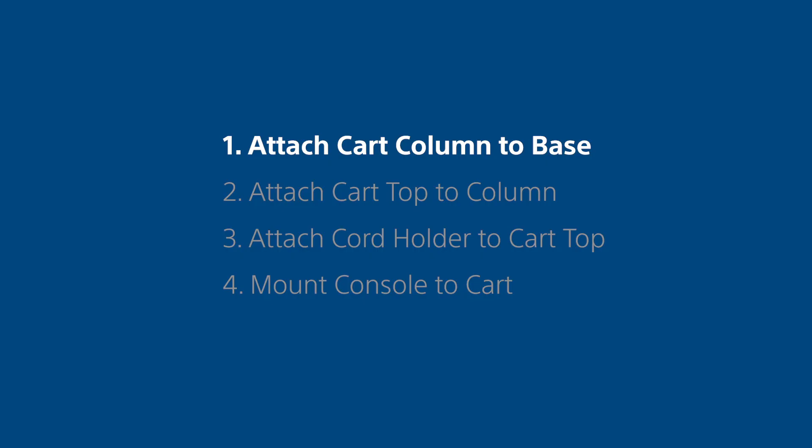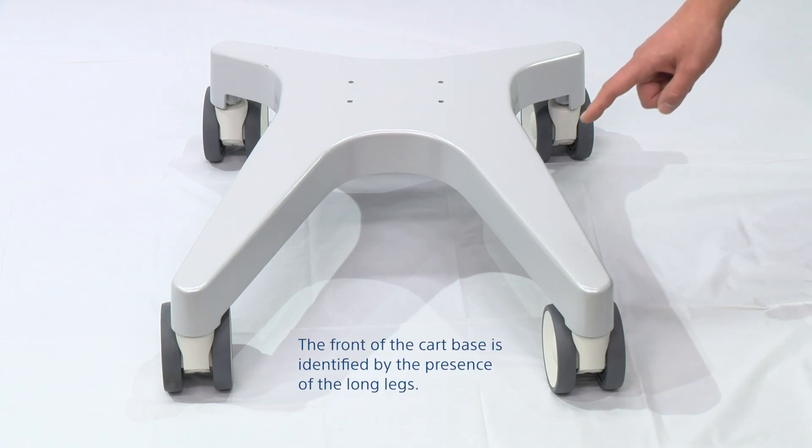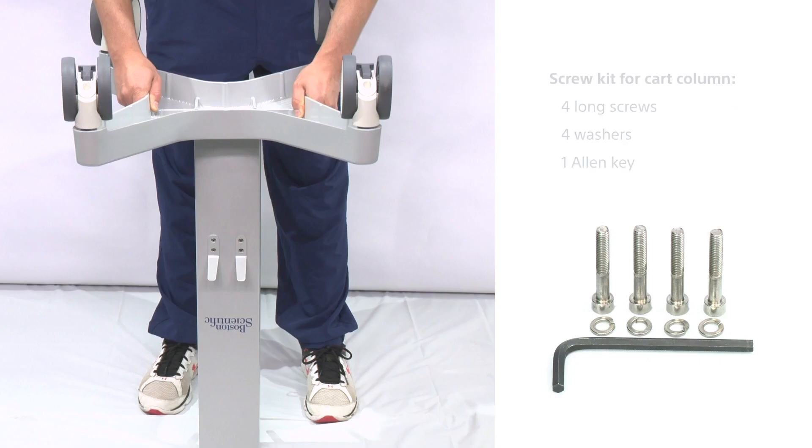Step 1: Attach the cart column to the base. The front of the column is identified by the presence of the Boston Scientific logo. The front of the cart base is identified by the presence of the long legs. Make sure you have the long screws, washers, and the allen key close by.